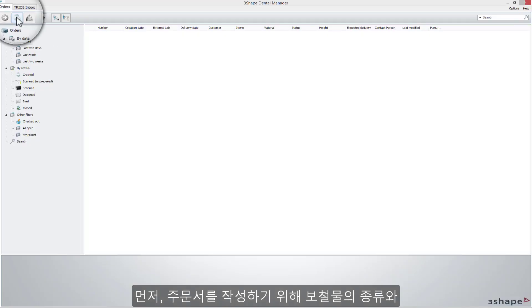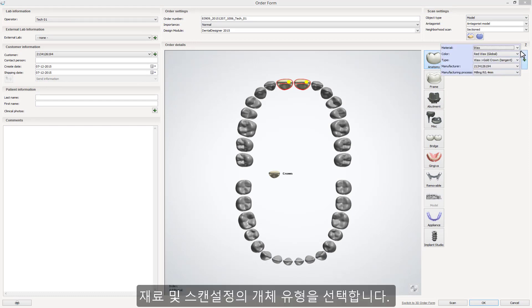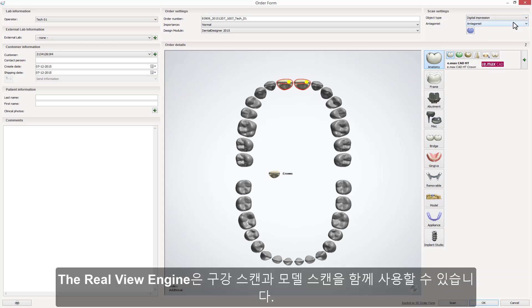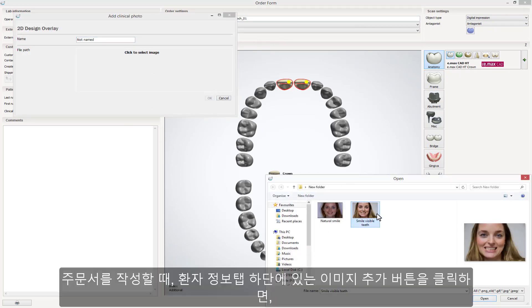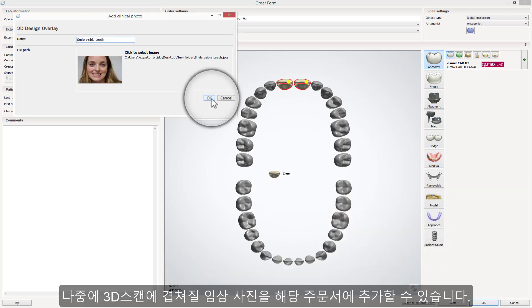Start by creating a new order, choosing the required type of restoration, material, and type of impression. The RealView Engine can be used with intraoral scans as well as with scans of plaster models. While creating an order, under the patient information, you can add a clinical photo to that order that will later be overlaid on the 3D scan.